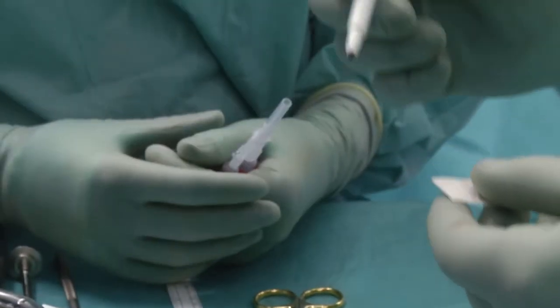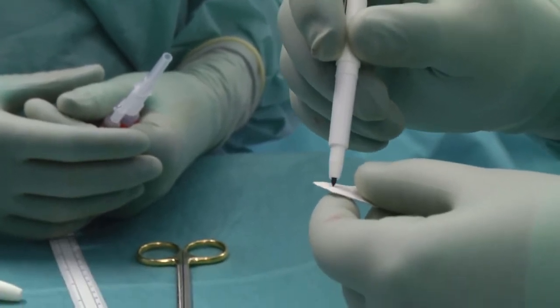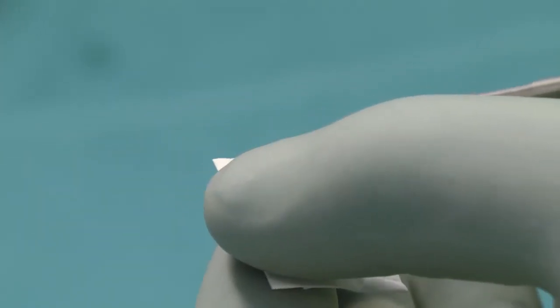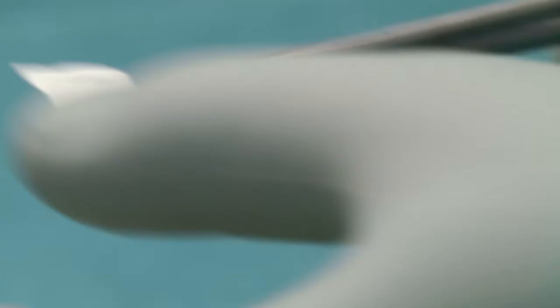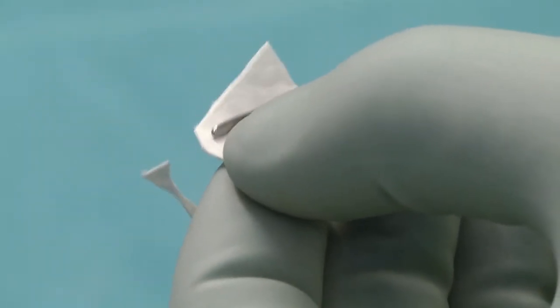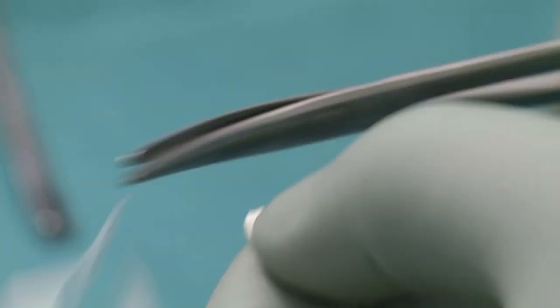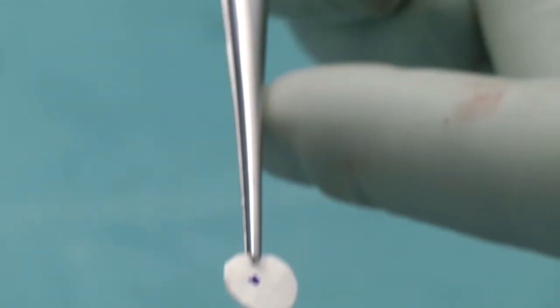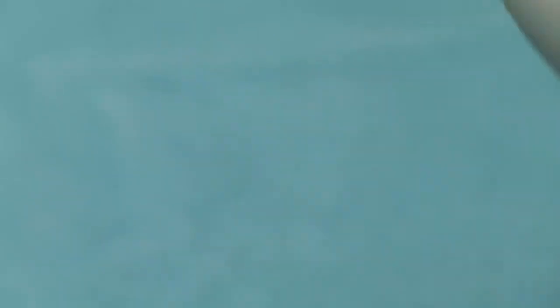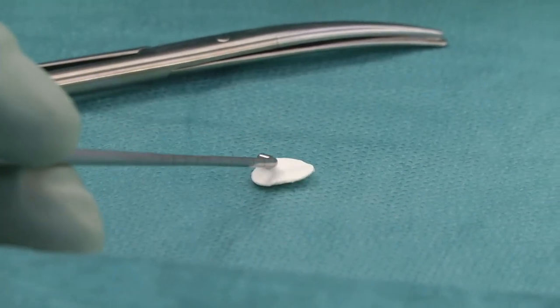The articular side of the membrane can be marked with a sterile pen. The membrane is cut back to defect size. It has to be considered that the Chondro-Gide membrane will swell by approximately 10% after hydration. At the customized membrane, the bilayer structure is clearly visible. Before implantation, the size of the membrane is checked again.